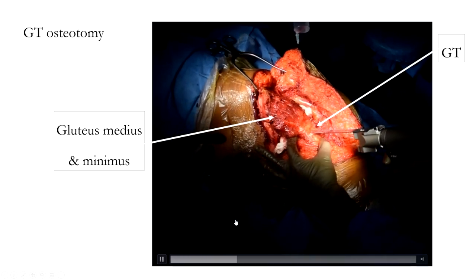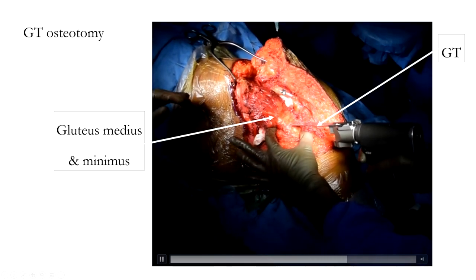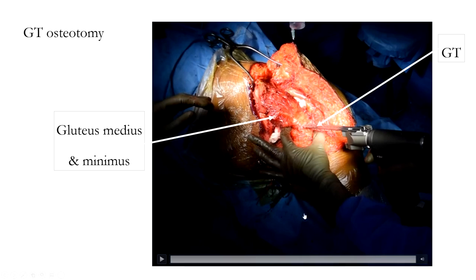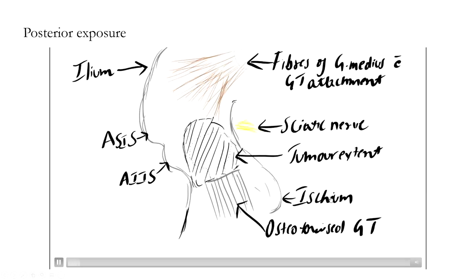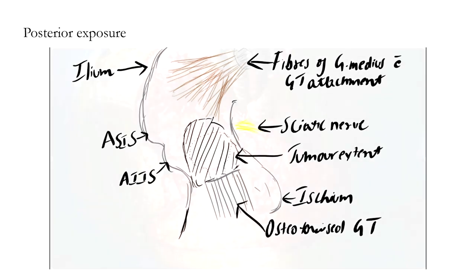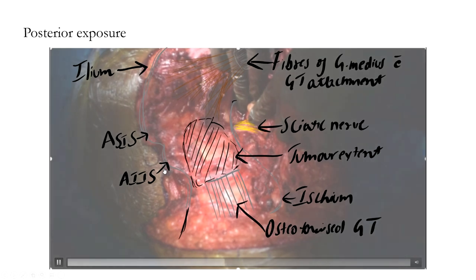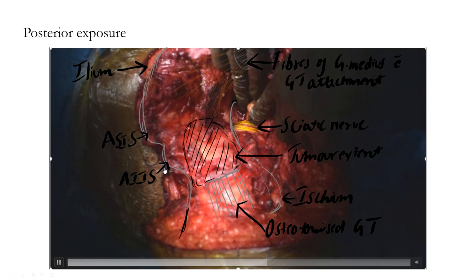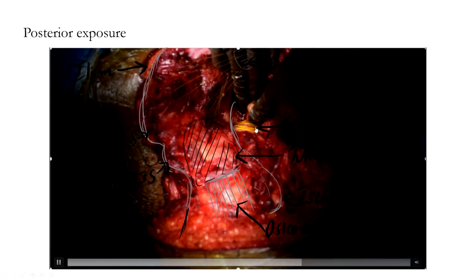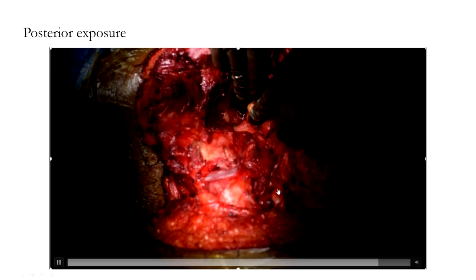A greater trochanter osteotomy was then performed to flip the gluteus medius and minimus insertions and expose the posterior ilium. Once completed and the fibres of the gluteus medius were elevated, the tumour area along the quadrangular plate was identified. A pictorial representation shows the ilium, anterior superior iliac spine, and anterior inferior iliac spine anteriorly, and the sciatic nerve and ischium posteriorly. On the table, the sciatic nerve is visible posteriorly, the ASIS anteriorly, and the osteotomy site and greater trochanter inferiorly — this formed the main area of tumour mass posteriorly.